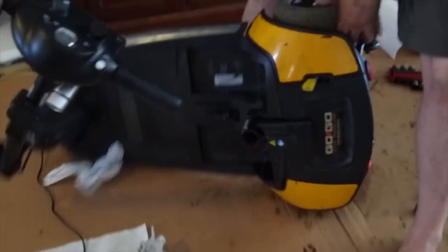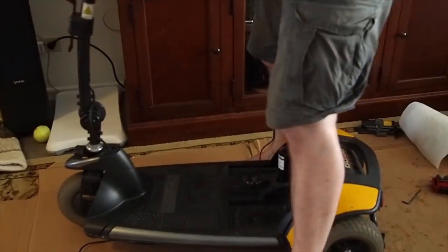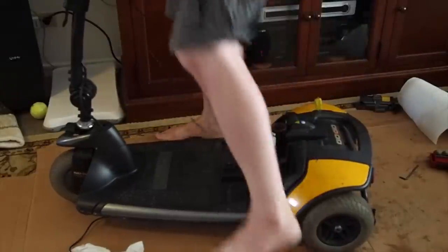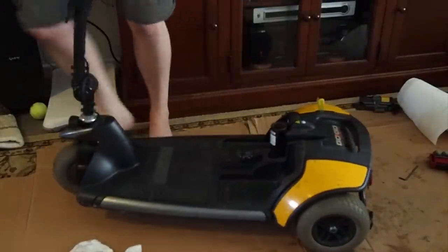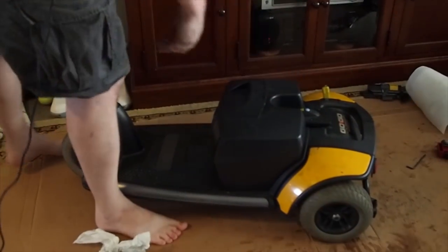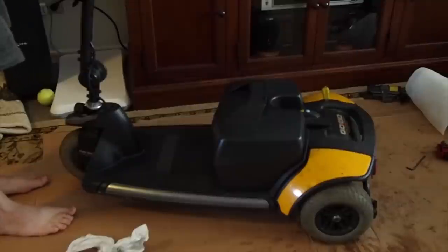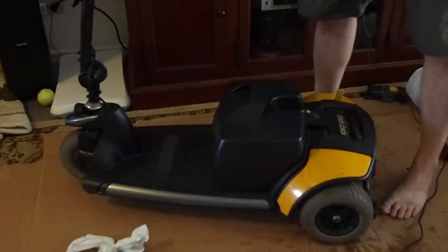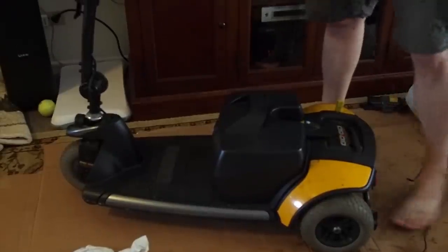Let's make this thing go right side up. Let's put that on like that. Let's hook up the cable, let's get a battery. I'm not going to bother with a seat. There's a battery, let's turn the bad boy on. That beeping means the clutch needs to be there. Okay, so now the thing seems to go.